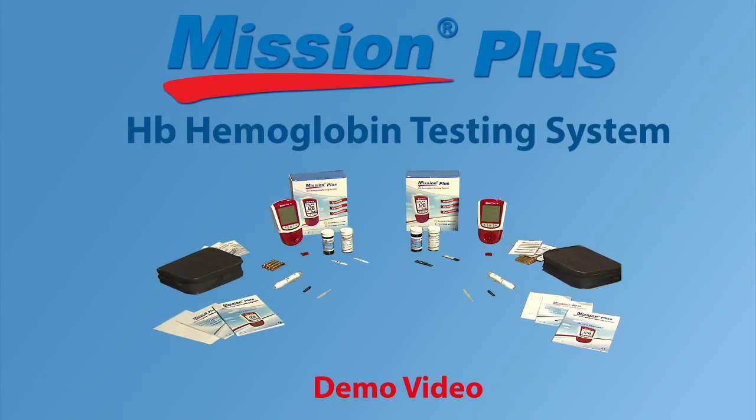Welcome, and thank you for choosing the Mission Plus HB hemoglobin testing system. This system is intended for the quantitative determination of hemoglobin and calculated hematocrit in capillary and venous whole blood.